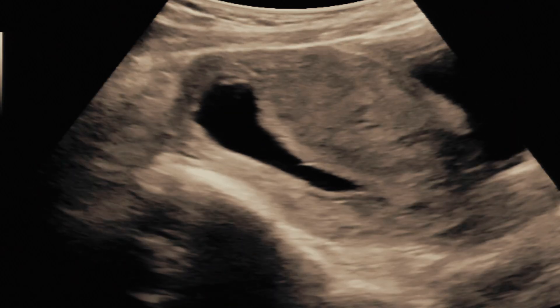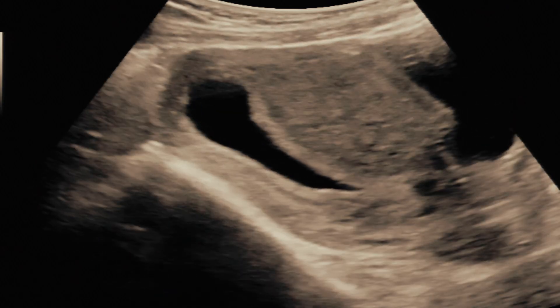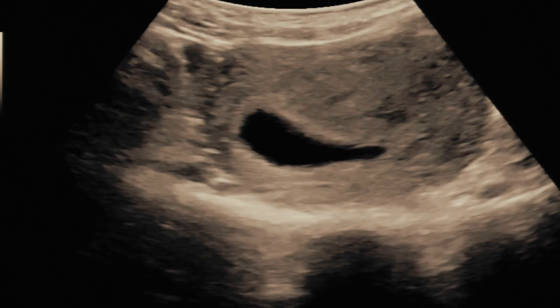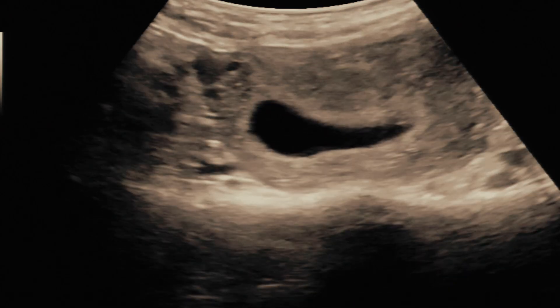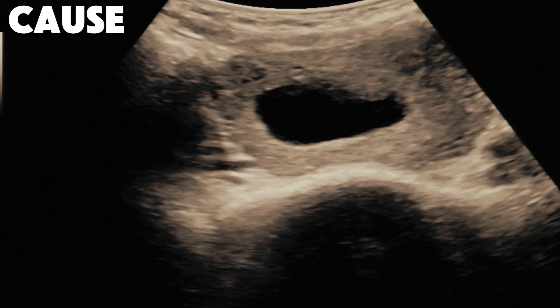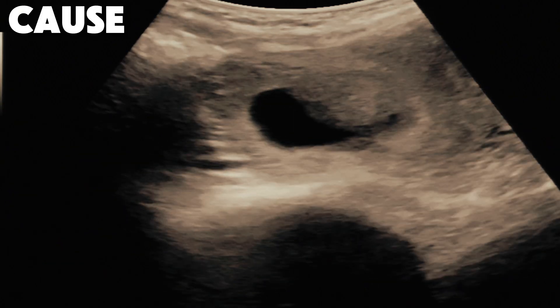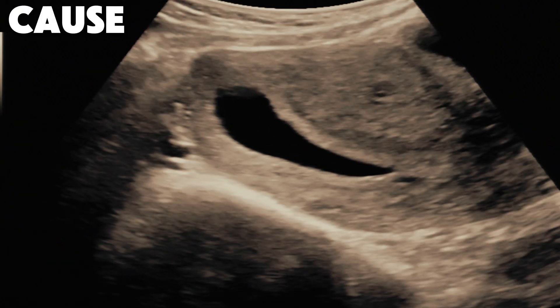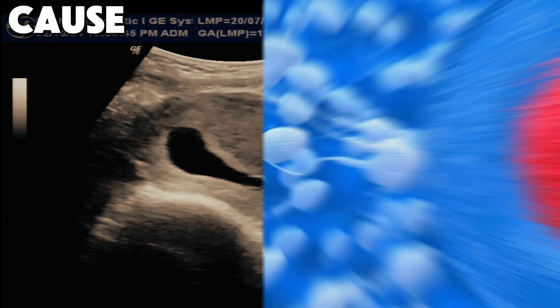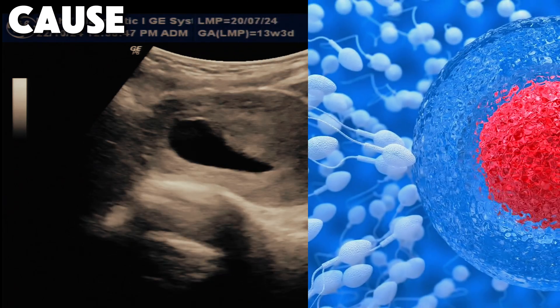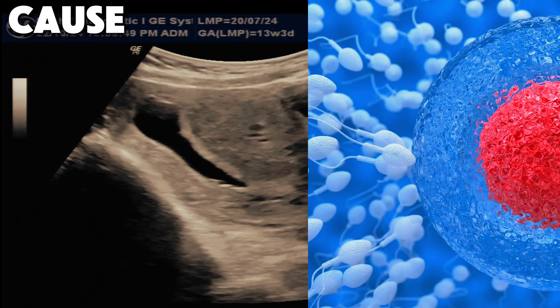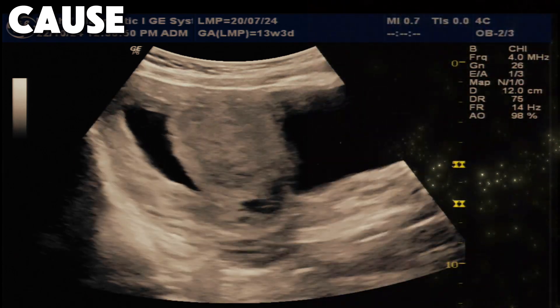This is an anembryonic pregnancy, also known as a blighted ovum. This is usually caused by chromosomal or genetic problems. This may be due to poor quality of sperm or egg, or may occur due to abnormal cell division.